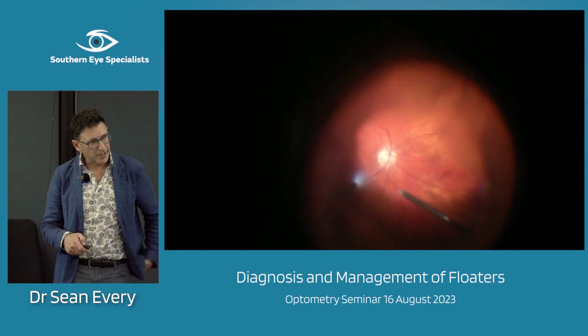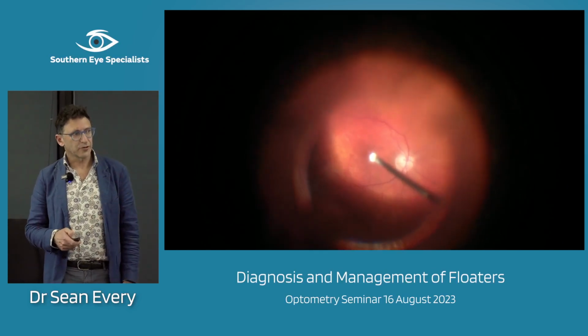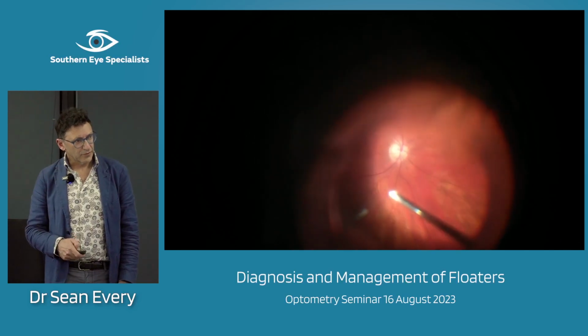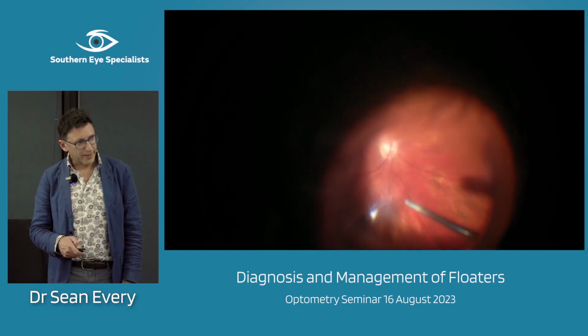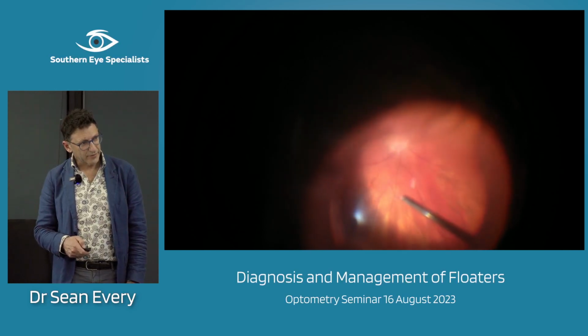I'm pretty sure this person's obviously had a PVD, so I don't have to do that step to surgically induce the PVD. Don't think I've got... It's still floating. Yeah, bang. I think it might have gone now. No, it's still hanging around. It's still a massive shadow there.